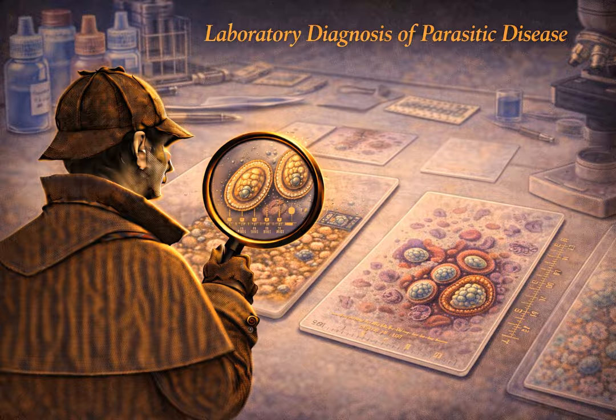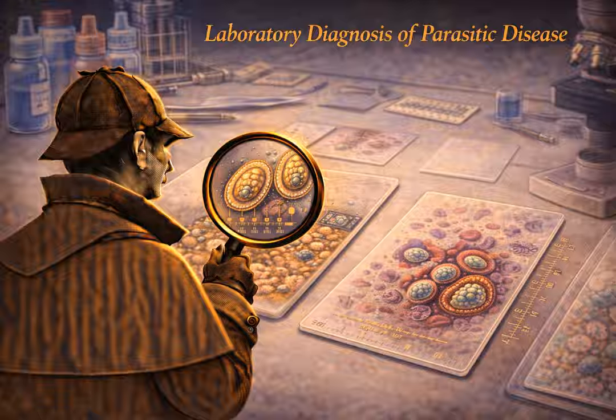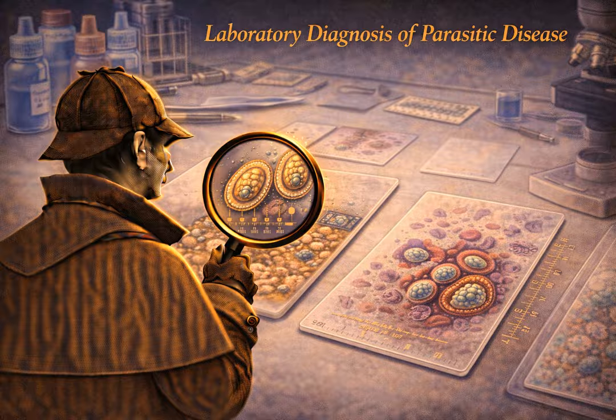Think about it. A pre-programmed PCR panel only ever finds exactly what it is explicitly programmed to look for. If a patient comes back from a remote jungle in a different country with a rare, totally unexpected parasite that simply isn't on that commercial 20-target panel, the expensive machine will just confidently print out negative. But the human eye, a curious, well-trained microscopist, would look at that strange slide and say, wait a minute, that doesn't belong here. What is that? The machine only sees the programmed data. The human mind sees the anomaly.